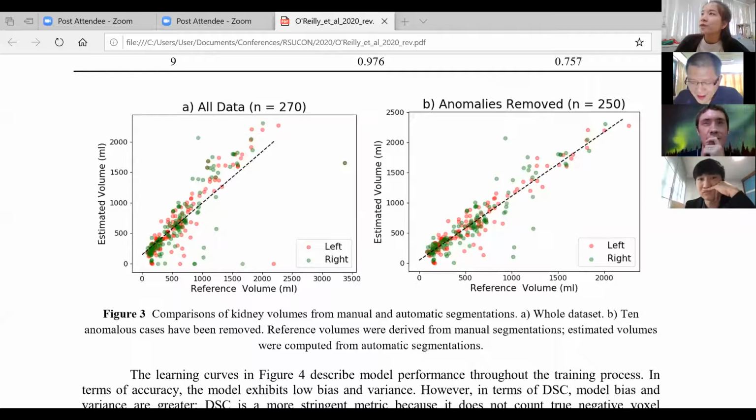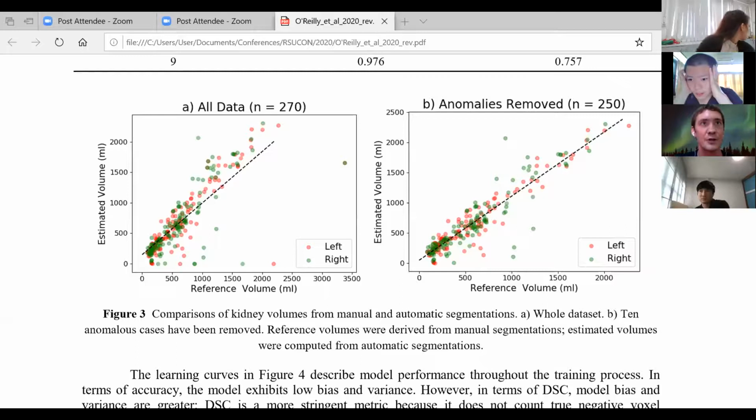The limitation, yes. One limitation is, as I mentioned, this is just semantic segmentation. So it just classifies kidney and non-kidney. It doesn't automatically do instance segmentation. That has to be applied afterwards. So if the two kidney regions overlap, they will just be automatically classified as one kidney. Essentially, one limitation is that this model does not perform instance segmentation. So it cannot separate between left and right kidney because it just uses a binary segmentation mask, 0 or 1.